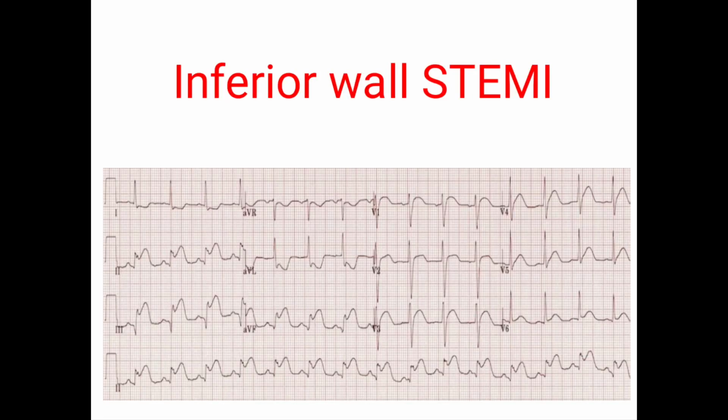Hi friends, in this video of ECG Basic, today I will talk about inferior wall ST elevation MI.